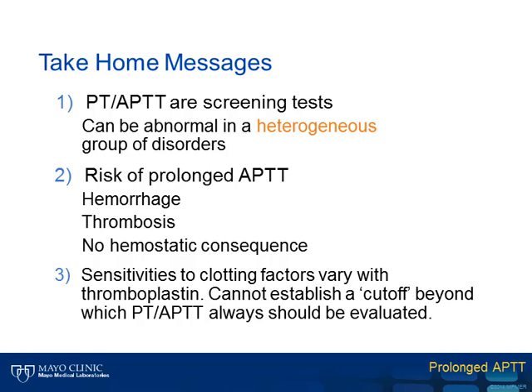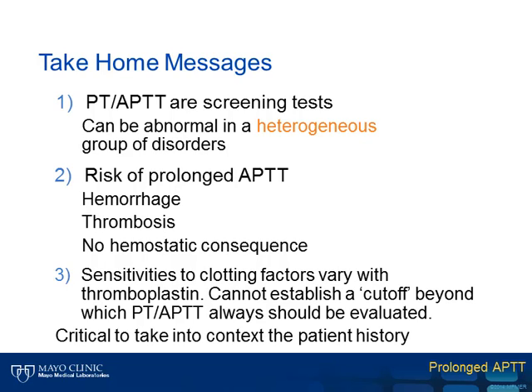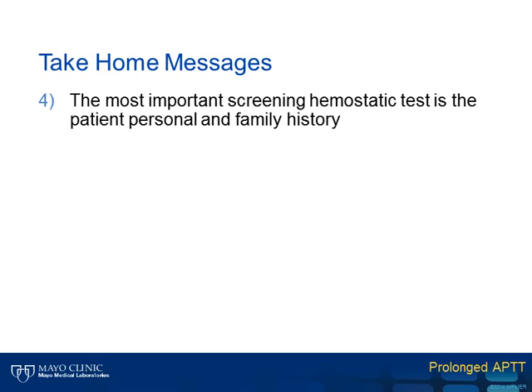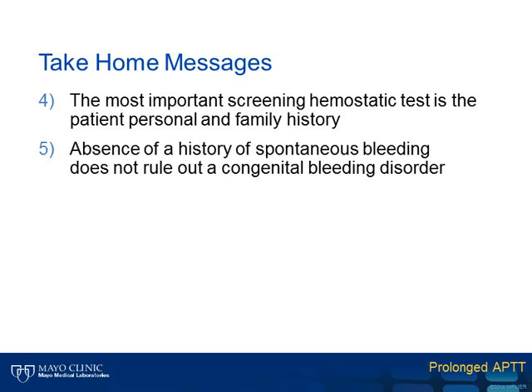Sensitivities to clotting factor deficiencies will vary with the thromboplastin, so one cannot establish a cutoff beyond which a prolonged APTT or prothrombin time should always be evaluated. It is critical to take the patient history within context of the lab result. The most important screening hemostatic test is the patient's personal and family history.